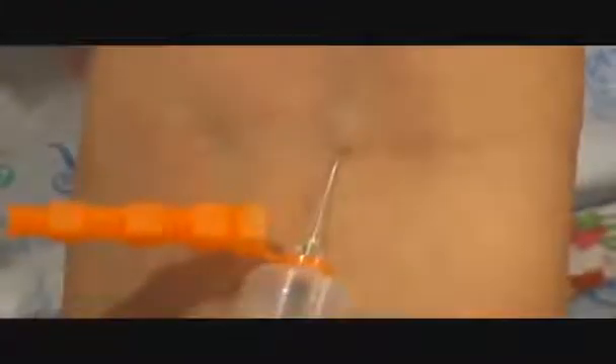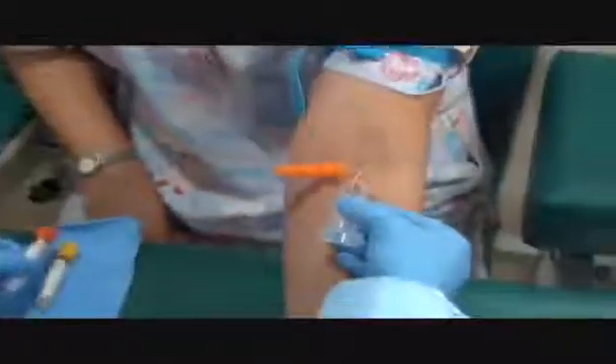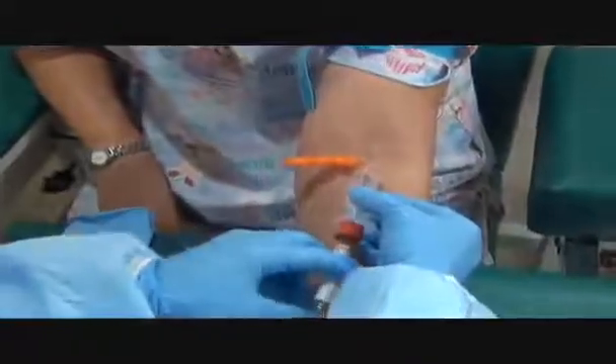Tying the tourniquet four inches above the site again. Please make a fist. Uncapping the needle and inspecting it for any defects. Take a deep breath.